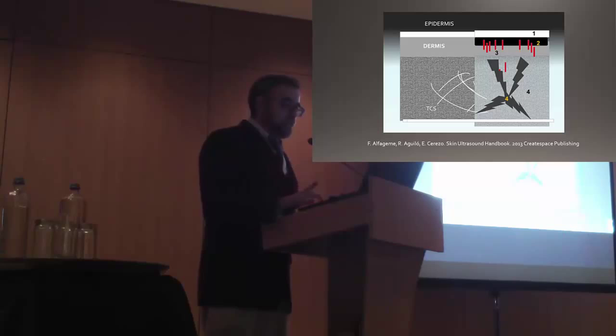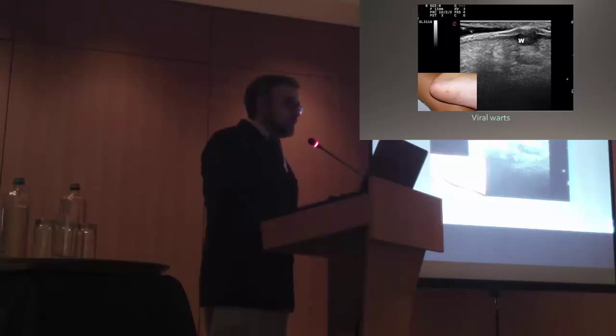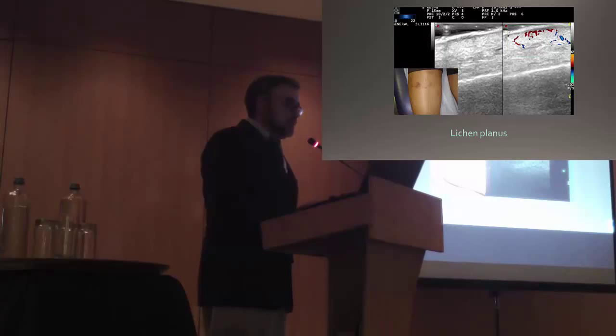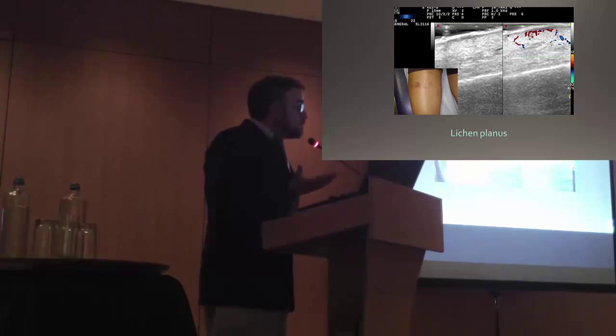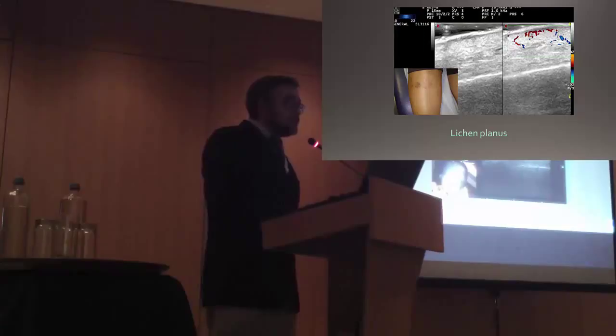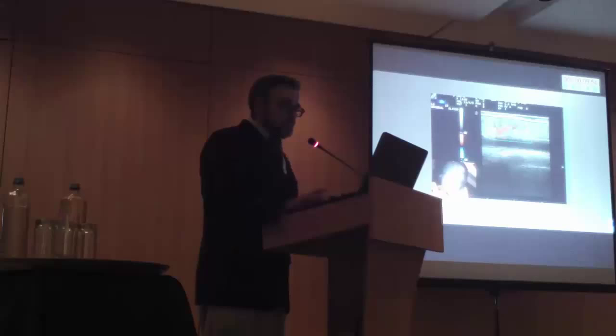For example, in a viral wart, this is normal skin and inflammation starts in the epidermis and goes up to the dermis. In the case of lichen planus, sometimes lesions are active, sometimes they are not — in this case we can tell this lesion is active. And in the case of hair follicles, we are now studying a case of tinea capitis, and we are seeing how the follicle is being destroyed by the Trichophyton.